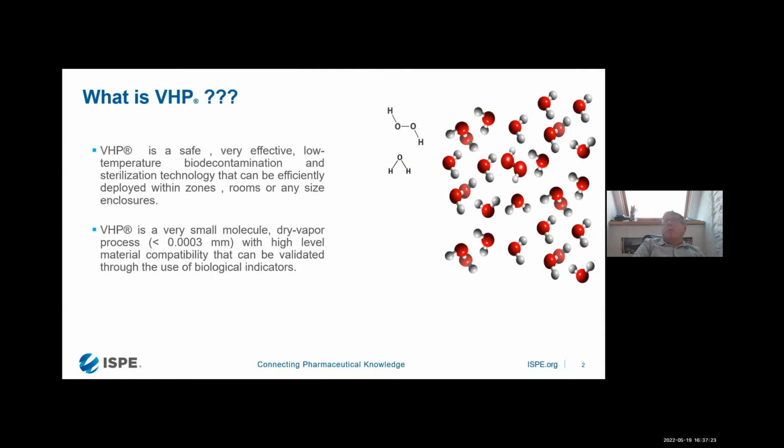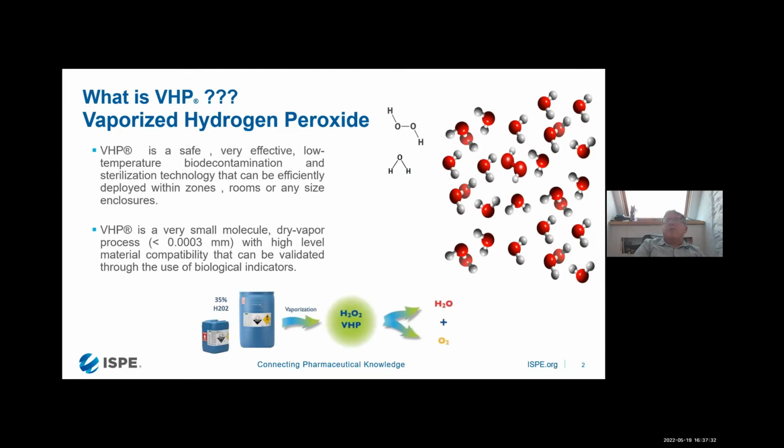And we are normally using a 35% solution, which is 35% H2O2 and 65% H2O. So this is a dry, gaseous technology used in vapor form to really decontaminate all kinds of surfaces, which can be in rooms, isolators, anything which requires decontamination up to a 6 log level.